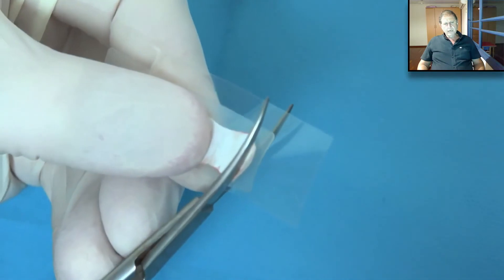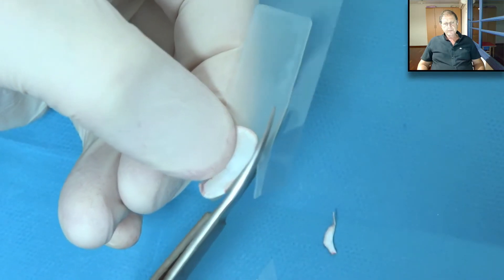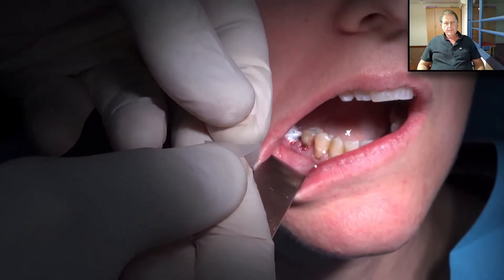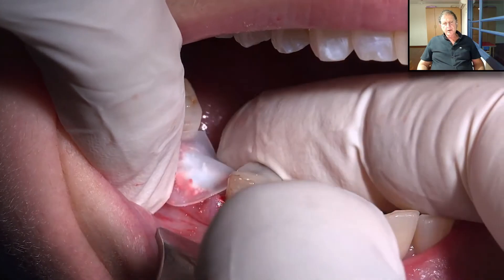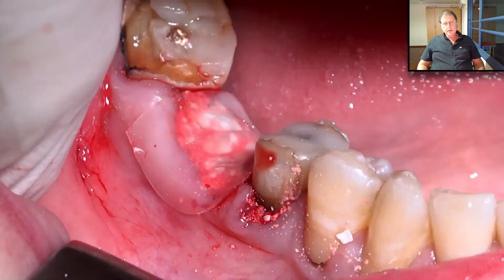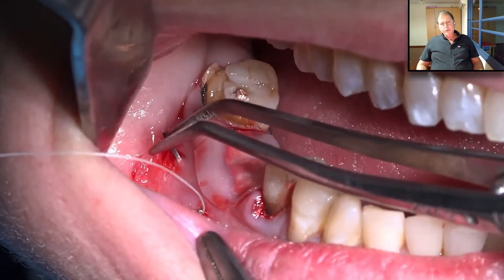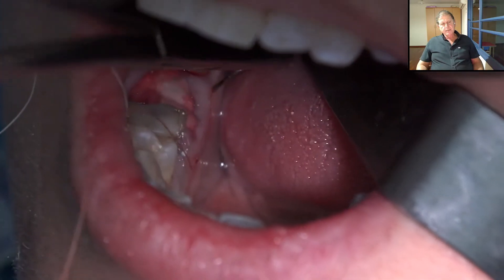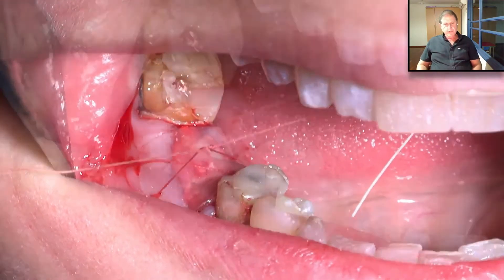Now we cut the Oraid accordingly and detach it from the liner. We place it on the gum and press — it sticks immediately. To secure it in place, we take a suture and go from the mesial side to the distal side, underneath the Oraid band, then go to the lingual side from one side to the other and make a cross suturing. It is very important to suture the Oraid.